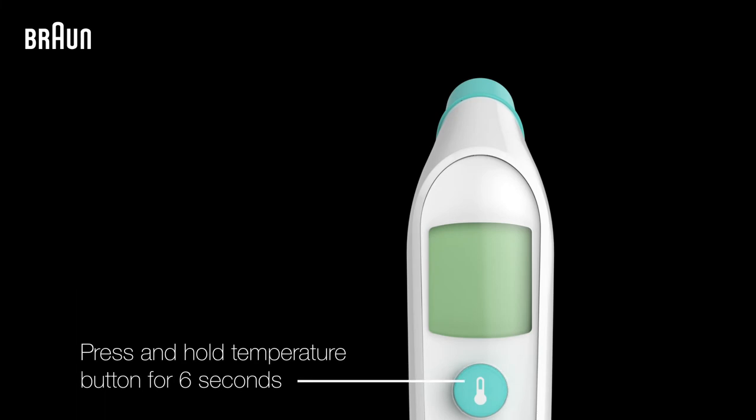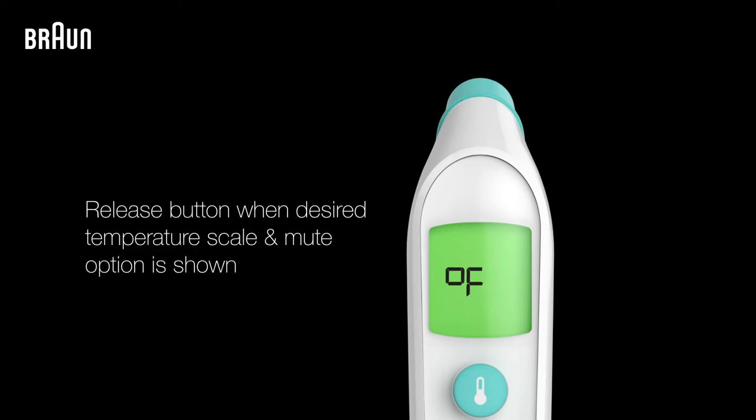Press and hold the temperature button for six seconds until 'set' appears on the screen. Release the button when the desired temperature scale and mute option is shown.